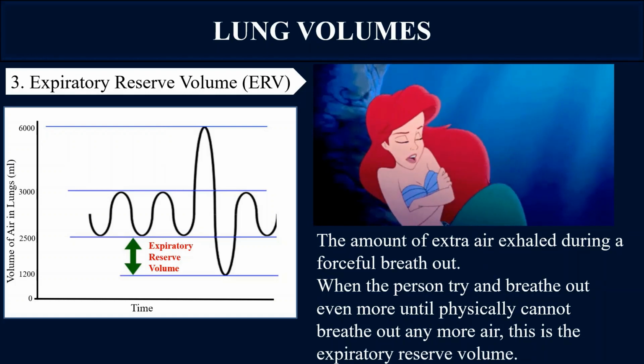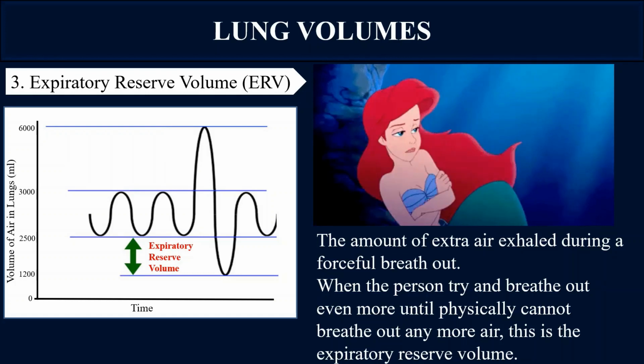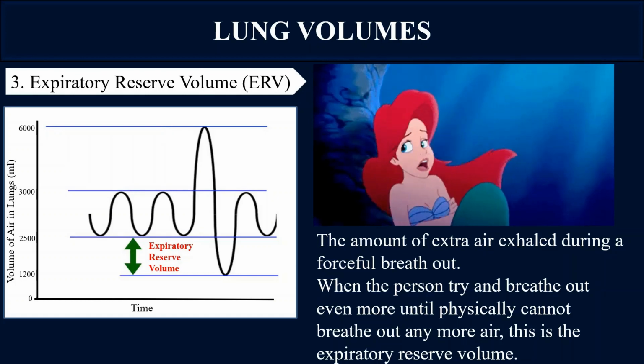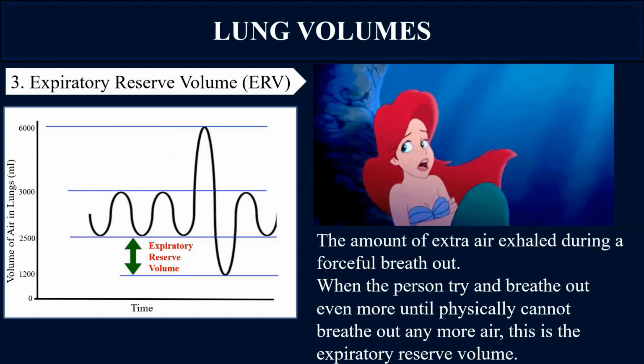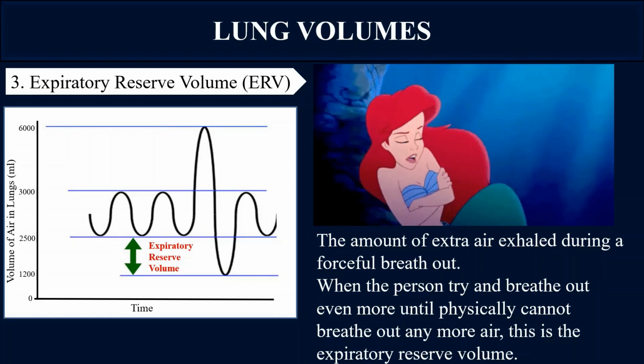So expiratory reserve volume is the volume after the normal expiration. When the person expires the air normally and then forcefully expires, exhaling to the maximum, this maximum exhalation of the air is known as the expiratory reserve volume.